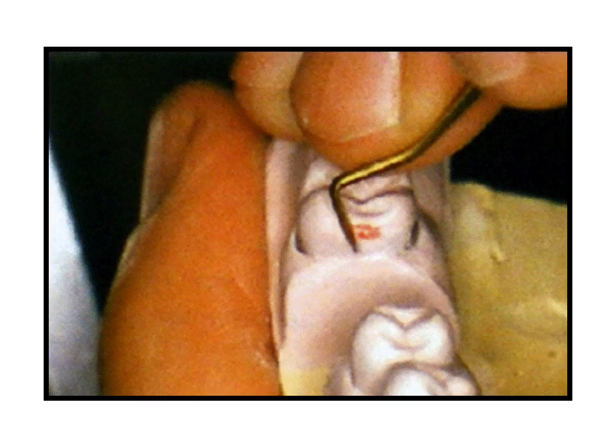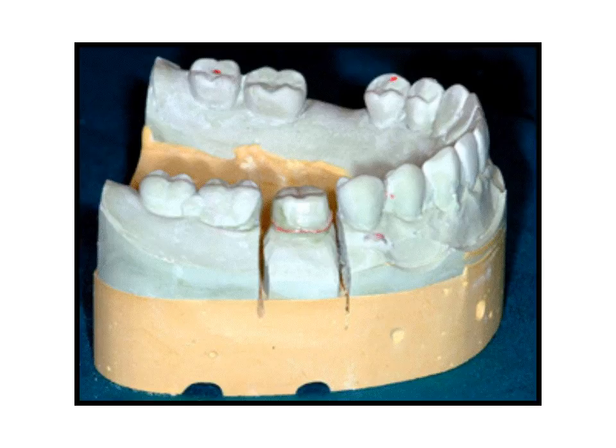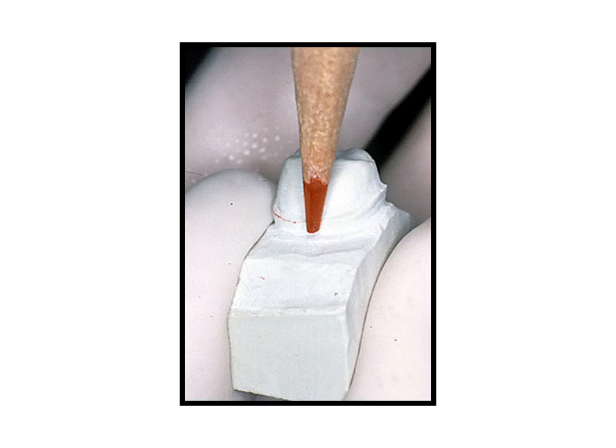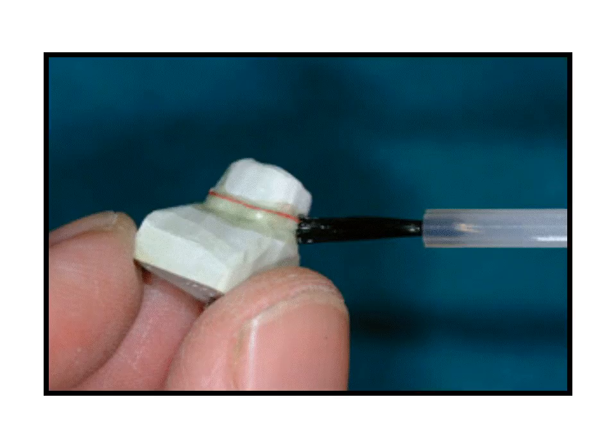To ensure that proximal contacts are not deficient, a small amount of stone is scraped from the adjacent tooth prior to waxing. The die is separated from the stone master cast and is stable, fitting on and off predictably. The margin finish line on the die is marked in red wax pencil — this color provides contrast with the blue wax. Traces of graphite from a regular pencil may cause incomplete casting because it acts as an anti-flux. The die is thoroughly saturated with die lube, and this process may be repeated periodically.